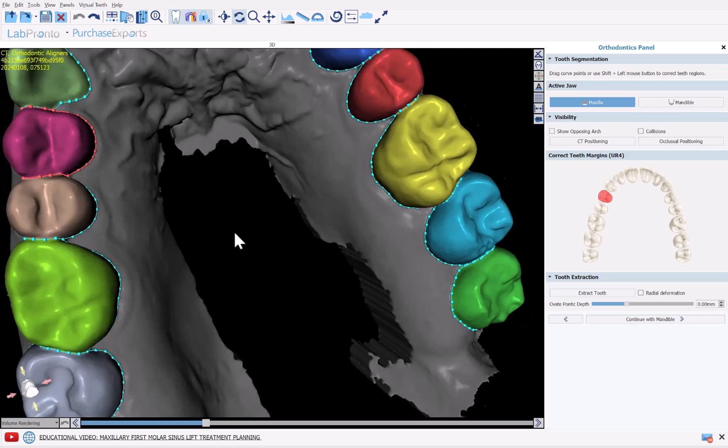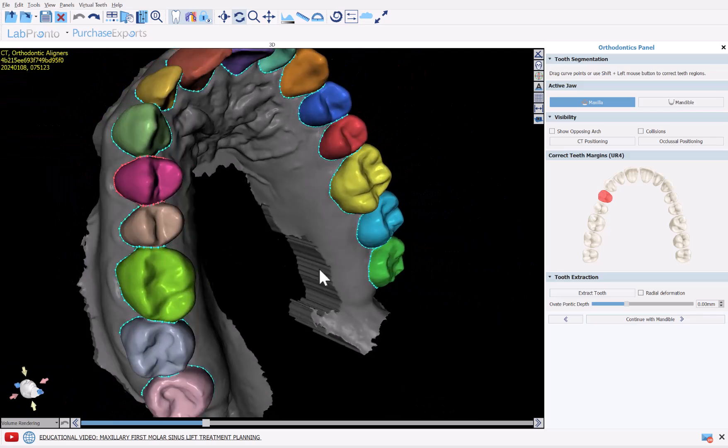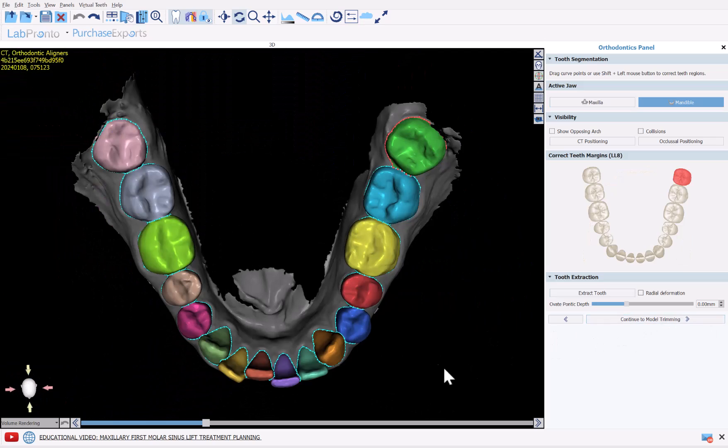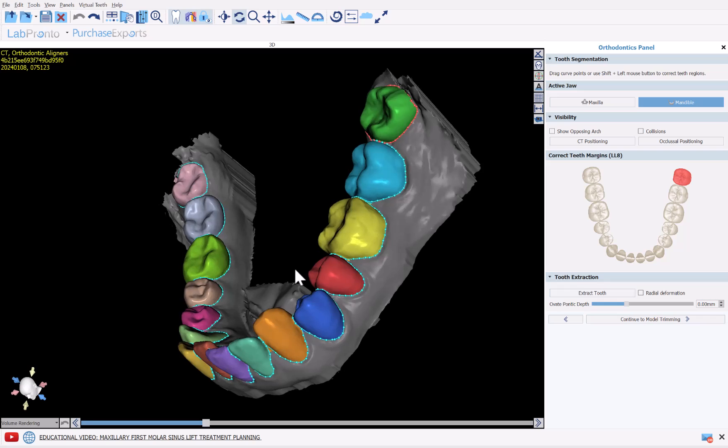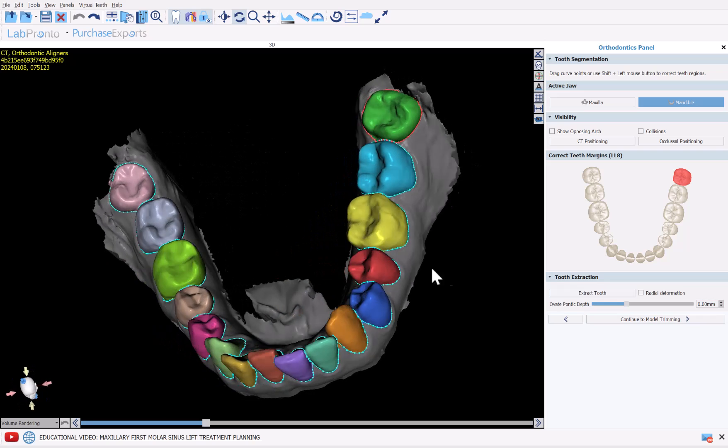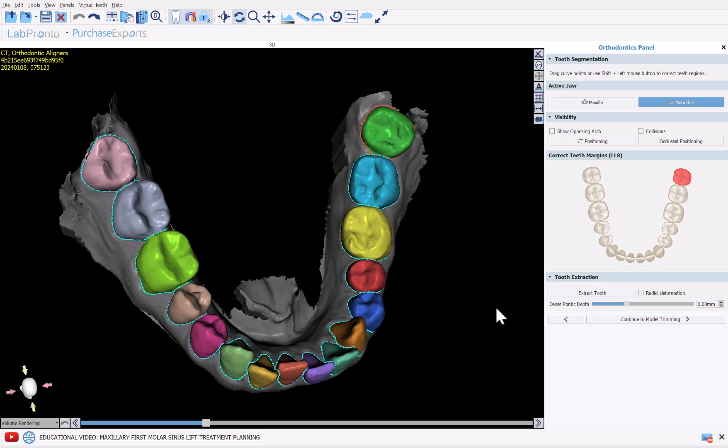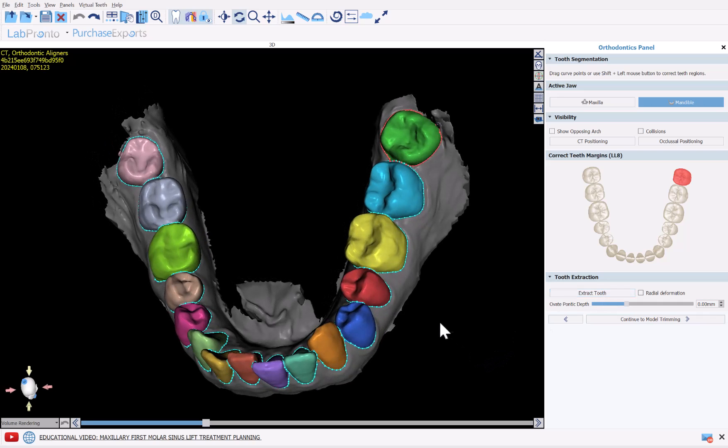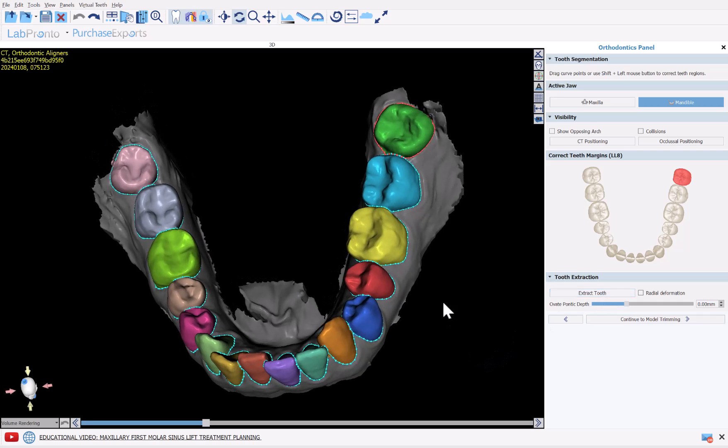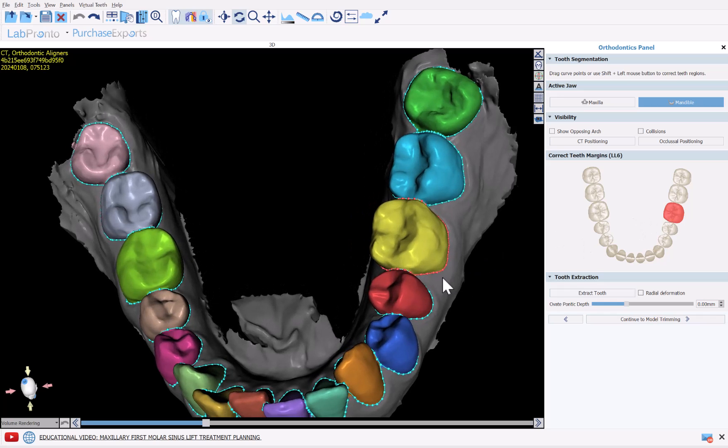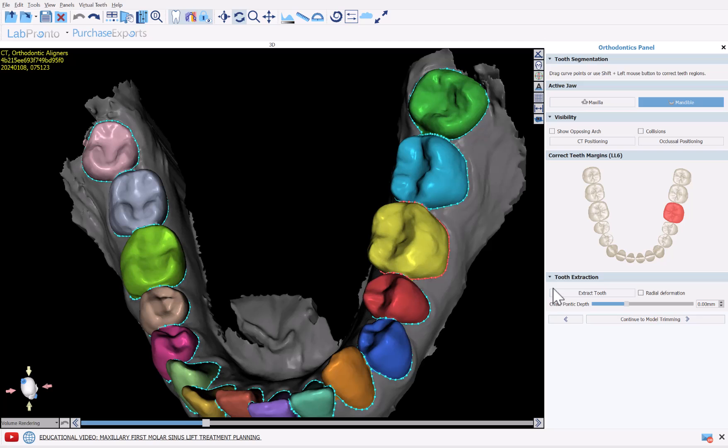I'm going to undo that. Once we've confirmed segmentation, simply click Continue with Mandible. We can once again review the segmentation and I'd like to point out new functionality that we have added to extract a tooth. If you'd like to extract a tooth, simply left click on the tooth so that it's active and has a red margin curve and you could simply click Extract Tooth.